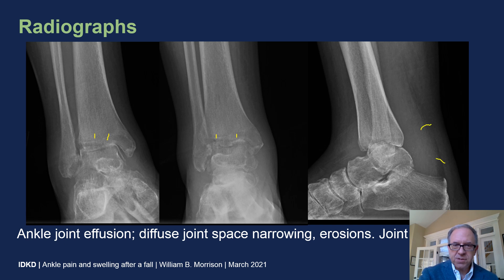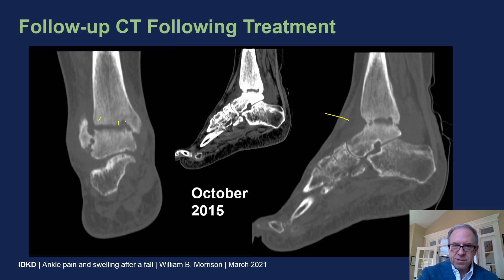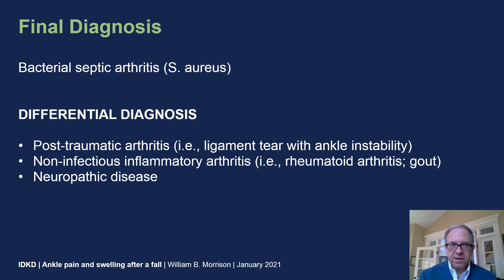There is diffuse soft tissue edema surrounding the joint indicating large joint effusion and surrounding pericapsular edema. A follow-up CT was acquired following treatment, and here you can see very nicely the erosions of the articular surfaces and the surrounding soft tissue edema. Final diagnosis after aspiration was bacterial septic arthritis with Staph aureus.